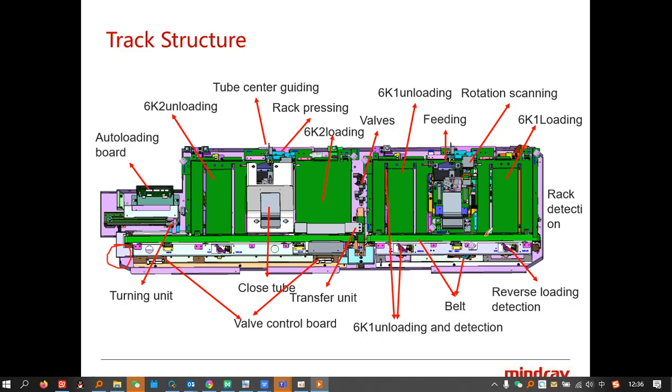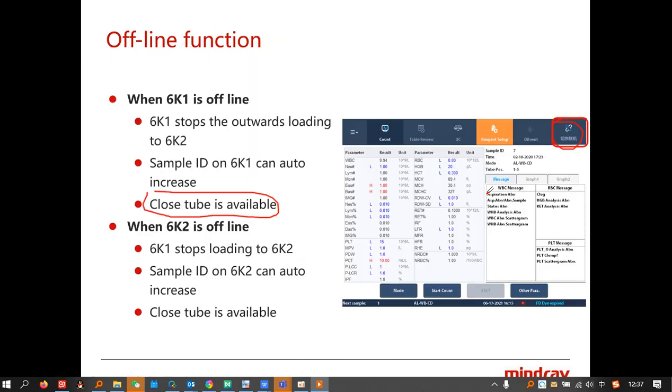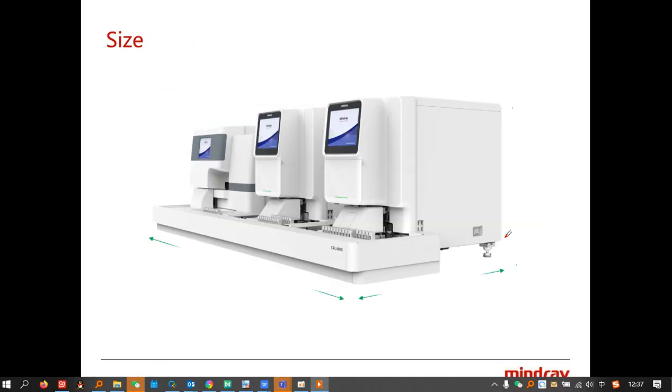Because if we have, for example, 20 racks and the capacity of the loading platform is about 15, as I remember, the rest of the racks should be handled on the loading platform of the second unit. We can't put the rack on the belt. We can only put them at the platform, here or here.